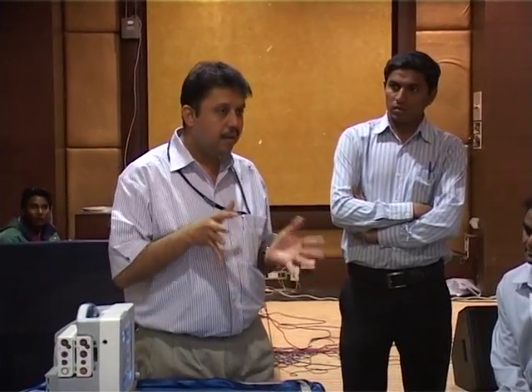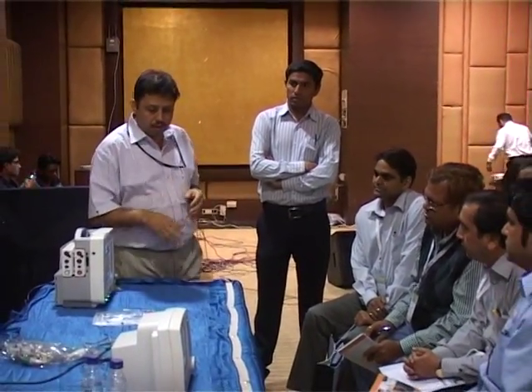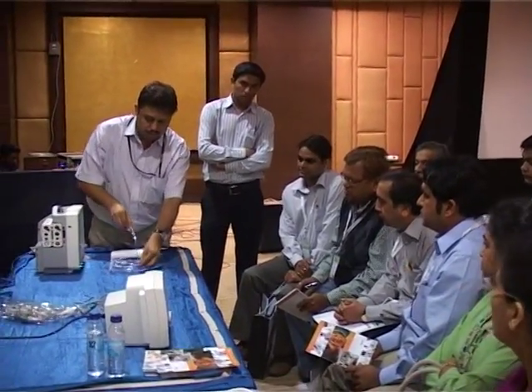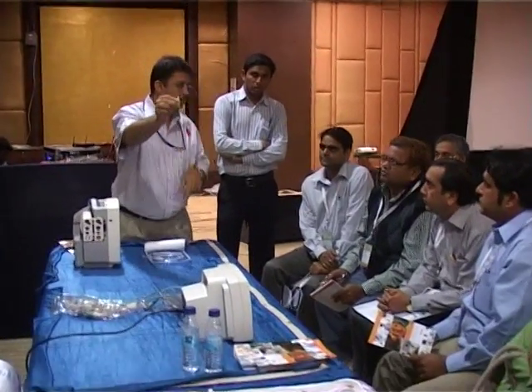It is important nowadays because it is less invasive and it is continuous. These two things are very important. So what we are doing, we are using a technology called PICO, and there is a very small catheter. This is the catheter, which is only required to conduct the entire process.